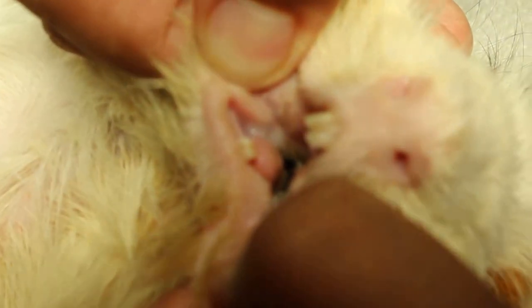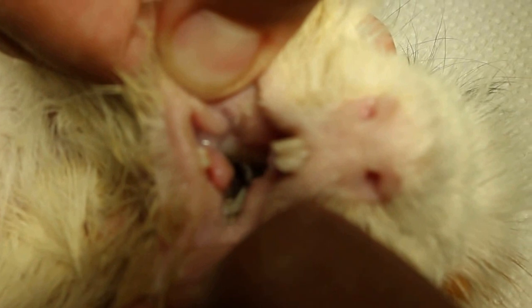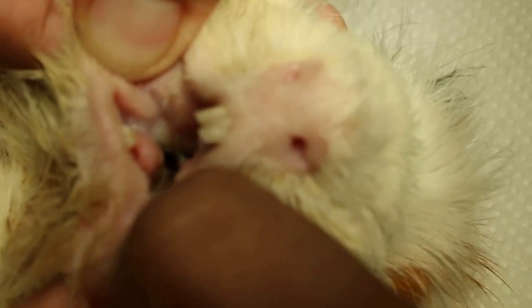This molar spur is from the right lower molar. So if you don't clip the molar spur, then this guinea pig will not be able to eat properly.